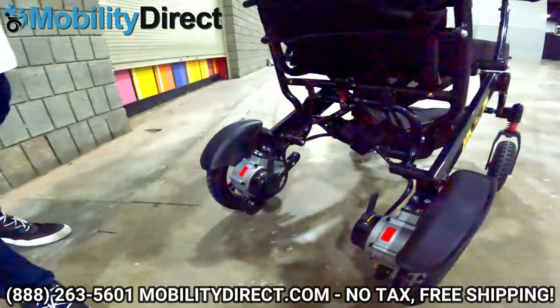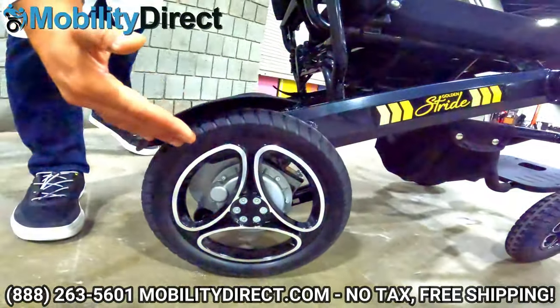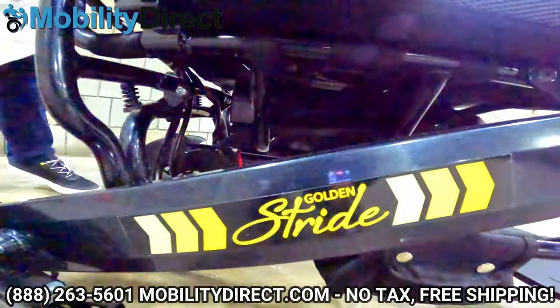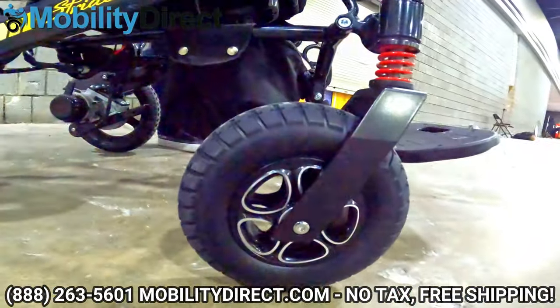It has big tires in the rear, so if you want to go on grass or terrain that's not necessarily hard flat surfaces, it will handle better than other power wheelchairs. In the front, you also have nice tires that are flat-free and puncture-free.